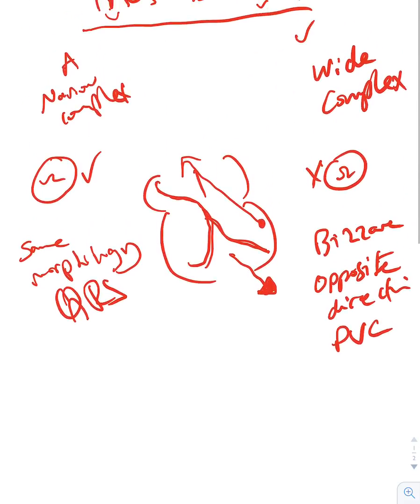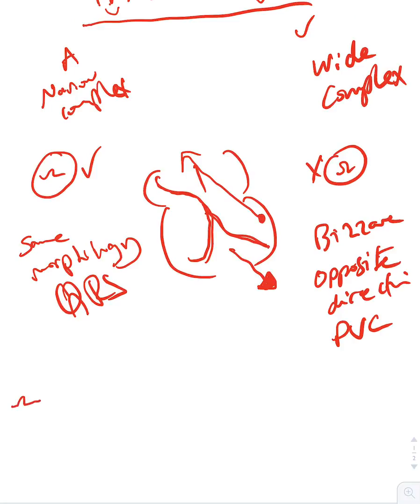Let me show you in an EKG or just a single strip, let's say that you have a sinus rhythm going in here, and then all of a sudden you see a beat that comes in a little bit earlier. You're gonna see that there's a small P wave and this P wave looks like it's before the QRS and this QRS looks the same as this QRS. If you're asked, what is this beat? You're gonna say, oh, this looks like sinus rhythm, but then this beat comes very early. Because it's narrow QRS and it has a P wave before it, this is most likely a PAC.